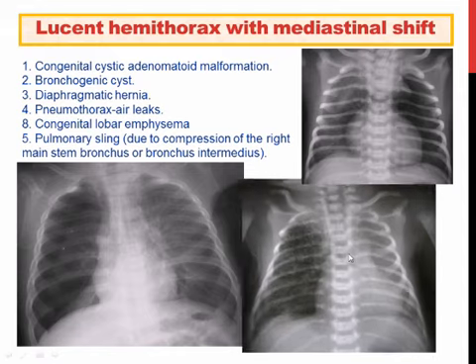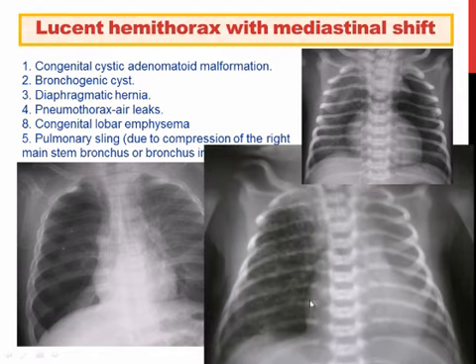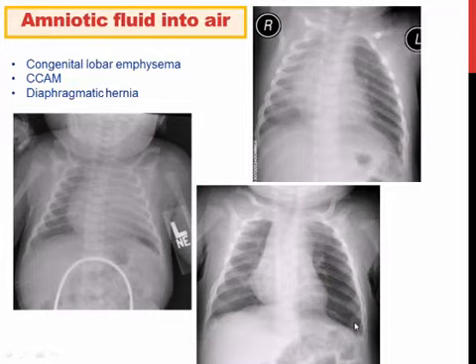And there's another situation of an air leak in the interstitium of the lung, and this causes small lucencies with a tubular or spherical shape because gas dissects into the interstitium, the pulmonary interstitial emphysema.